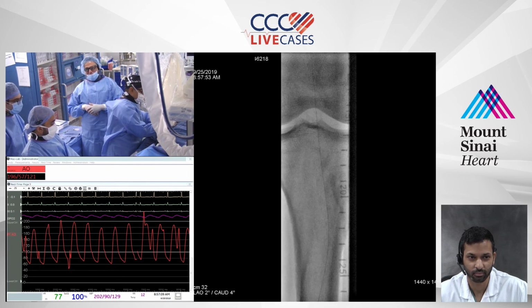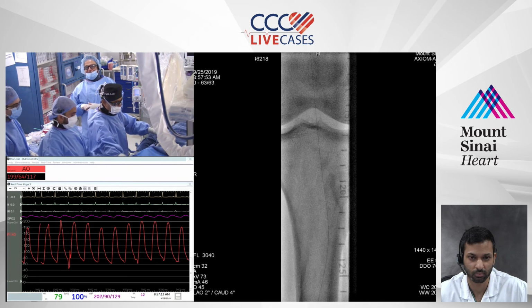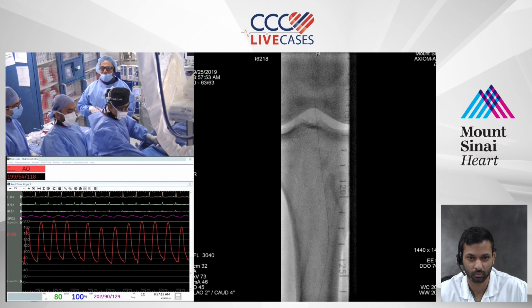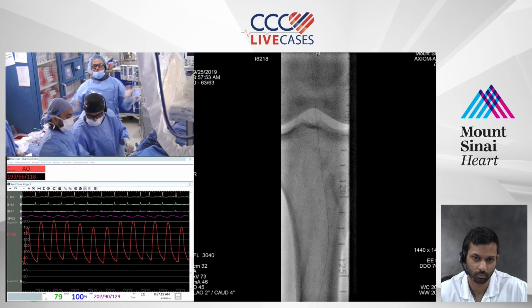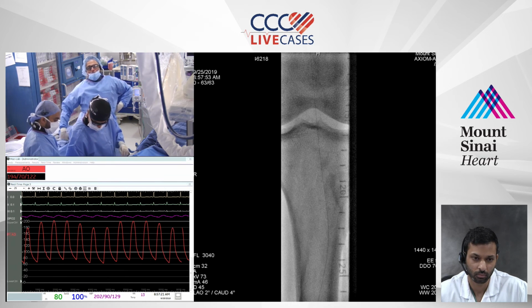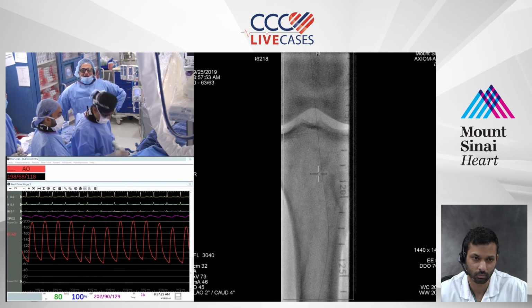And I think that's a great point that you make. I do also believe in objective exercise testing. If we can get them on a treadmill, especially if our PSVRs are elevated, we can see what the walking distance of this gentleman is, and what happens to his symptoms when we put him under stress, and then we'll do it.